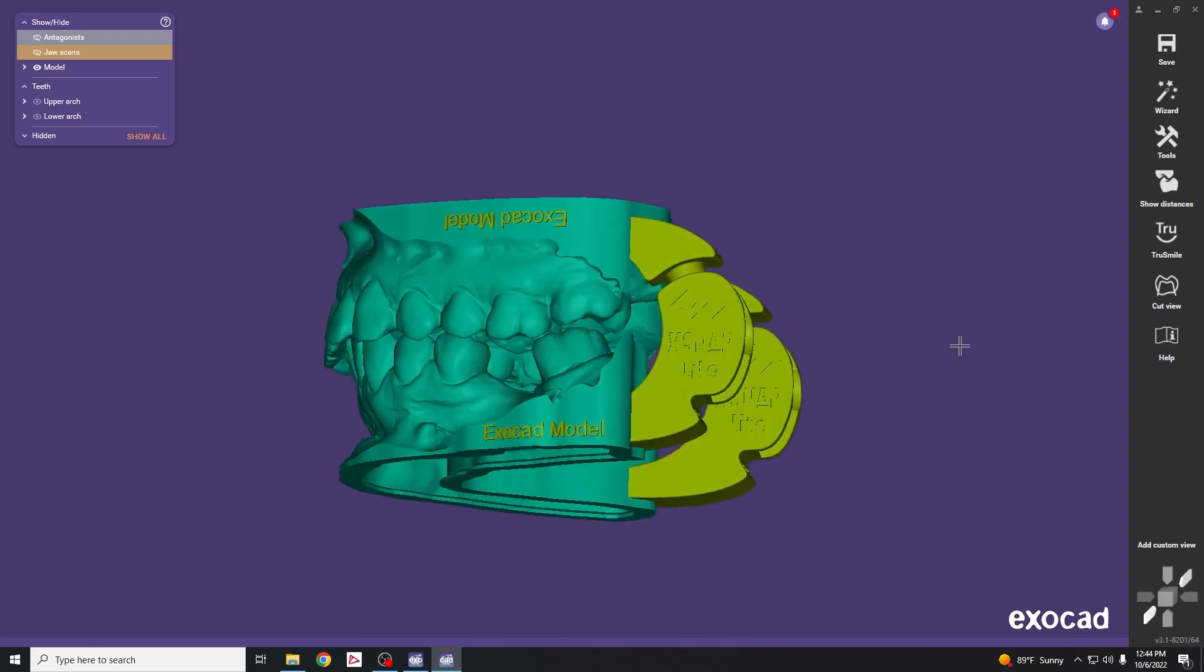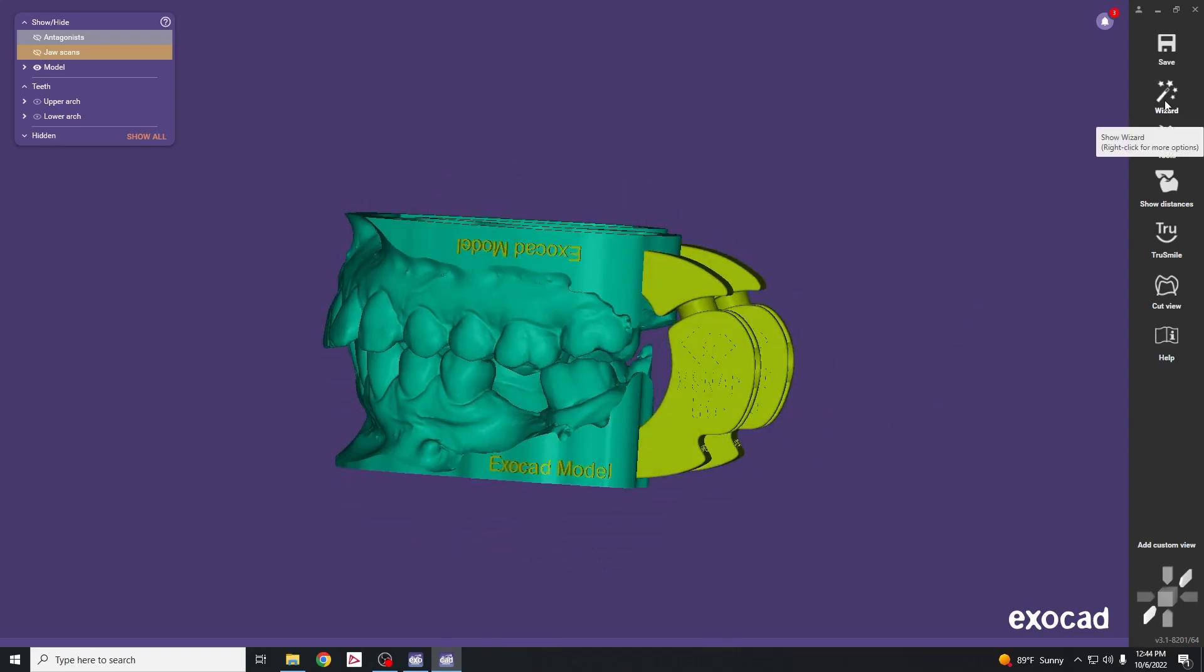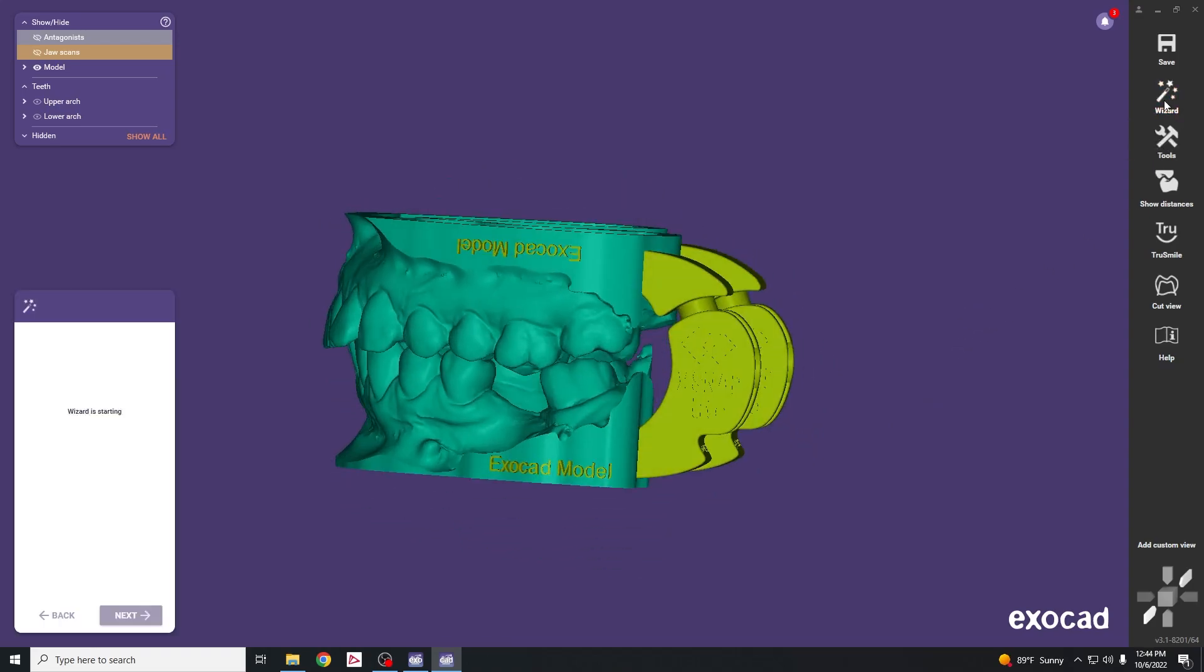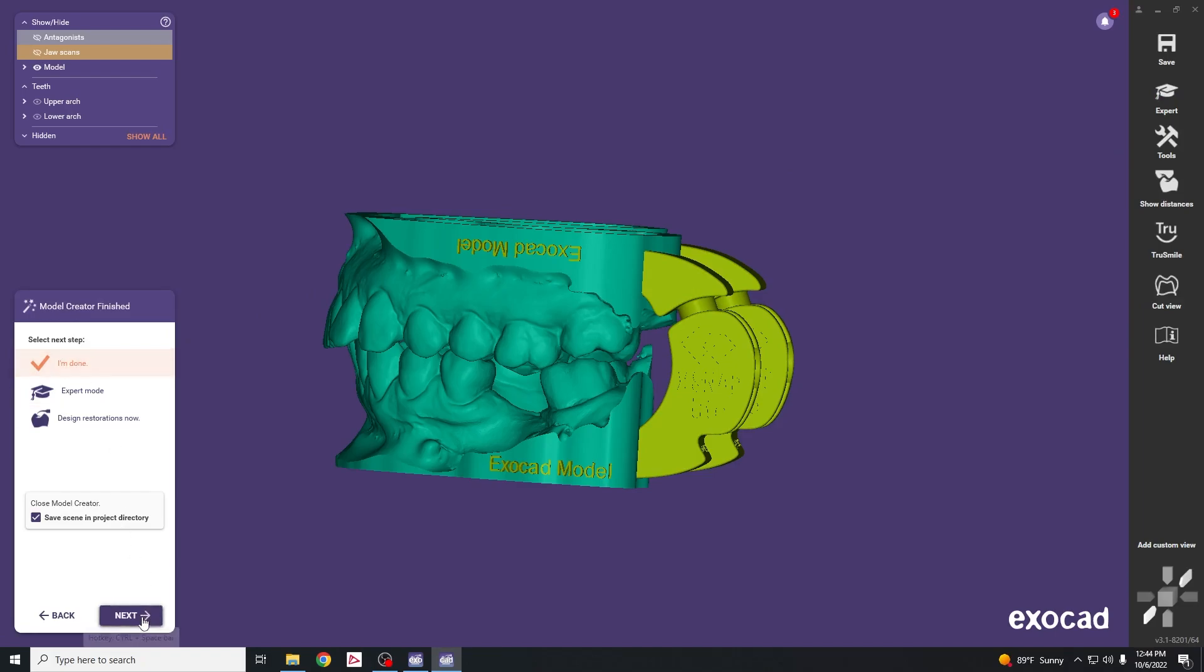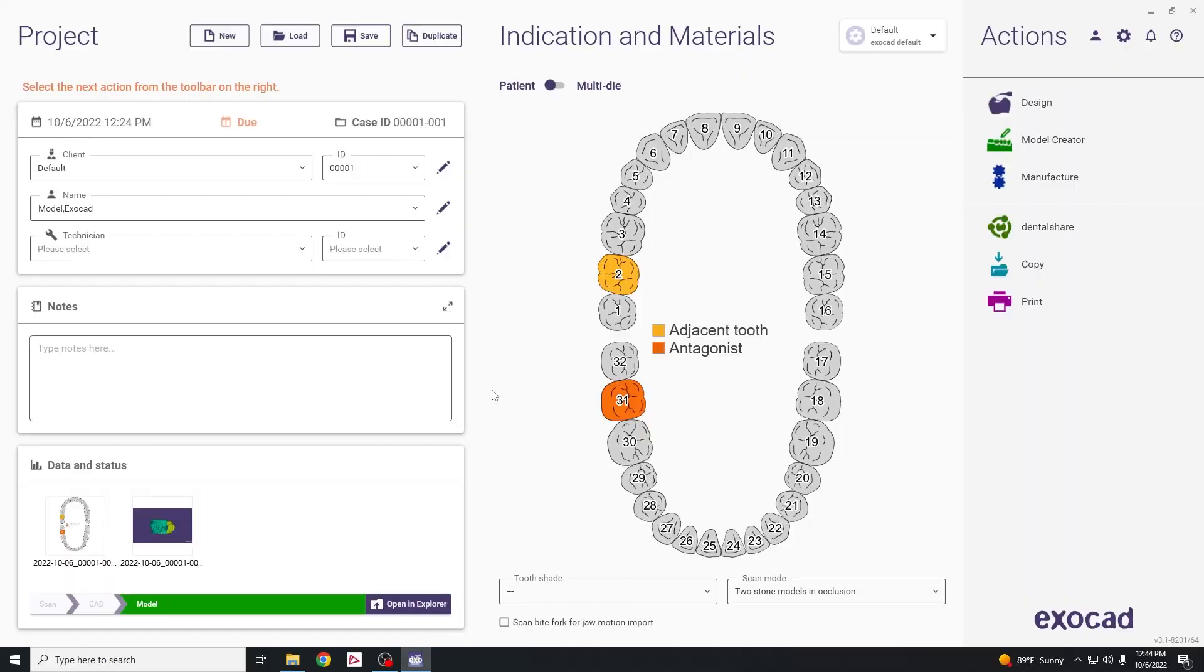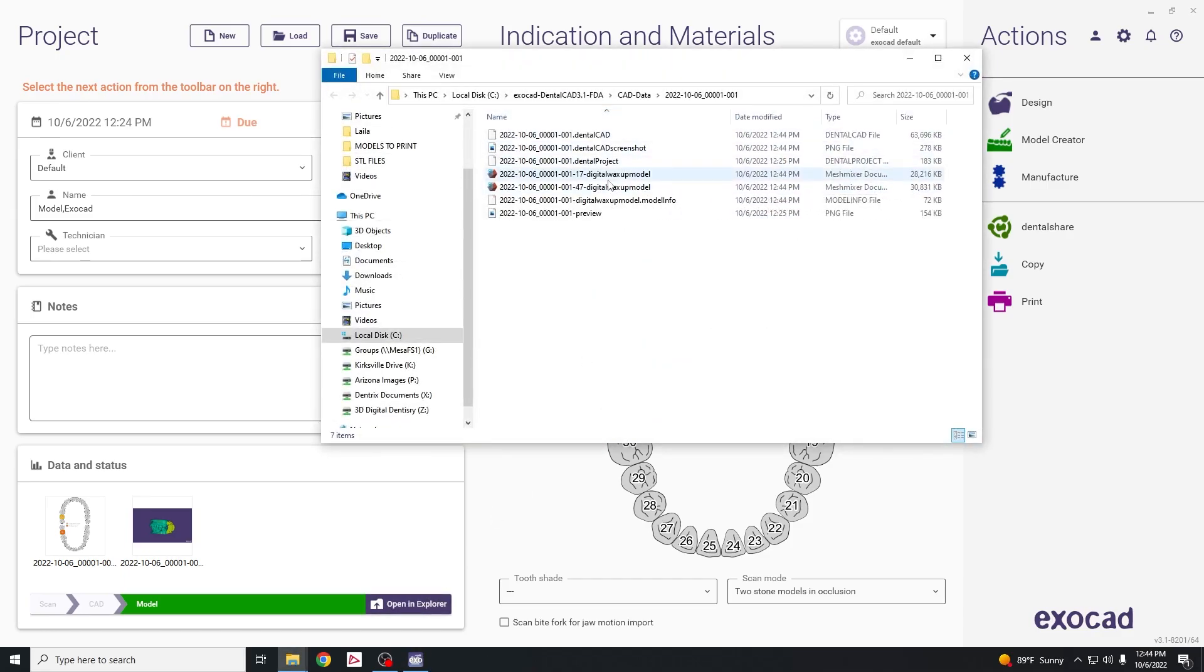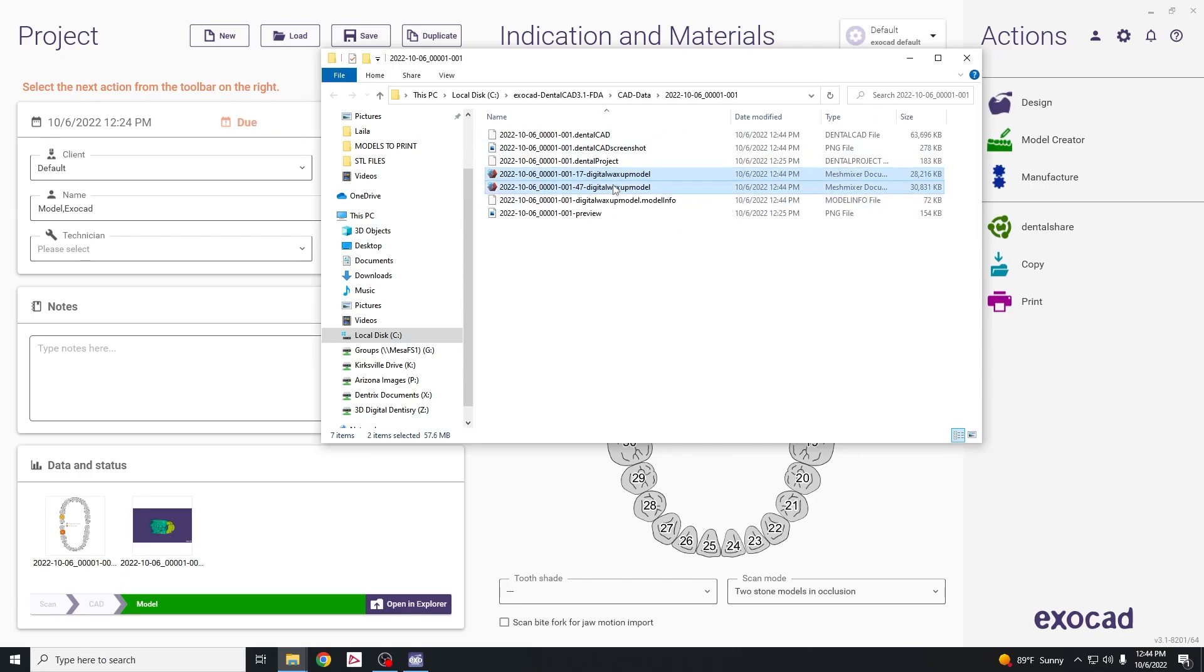Once the model has been completed, click on wizard and say I'm done, then hit next to export out the file. This brings us back to the start menu. Open the Explorer and select both files that say digital wax up model and copy that.